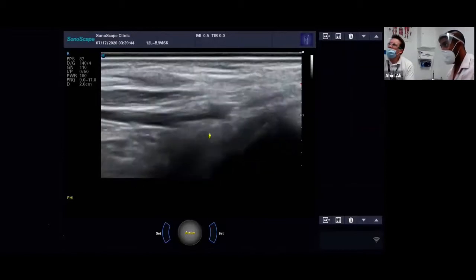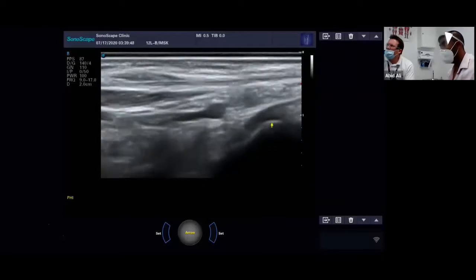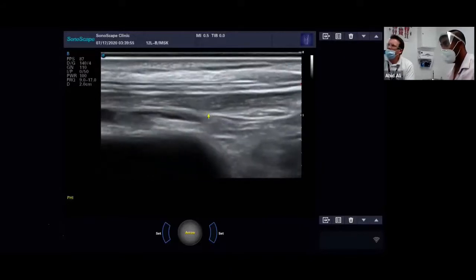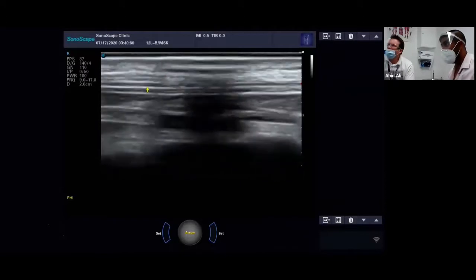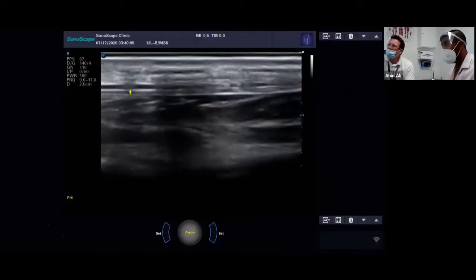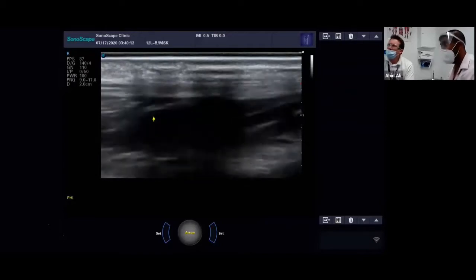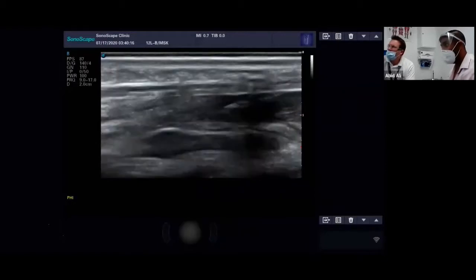So now we've passed over, can we just see the ankle mortise there underneath? Back there, aren't we? And now we're just passing up over. Now we're on to the lower tibia, and you can see we've still got the extensor hallucis in view. And now we're starting to lose it in the muscle layer, but we're still there. And can you see how far up the tibia we've come now? Right on the lower third of it. You can see the muscle belly underneath. And we're still following this tendon.